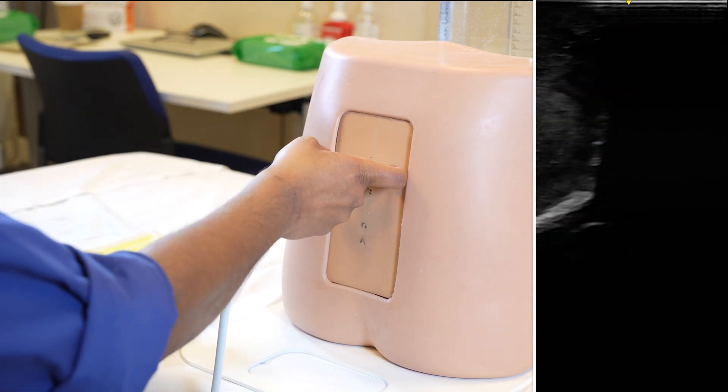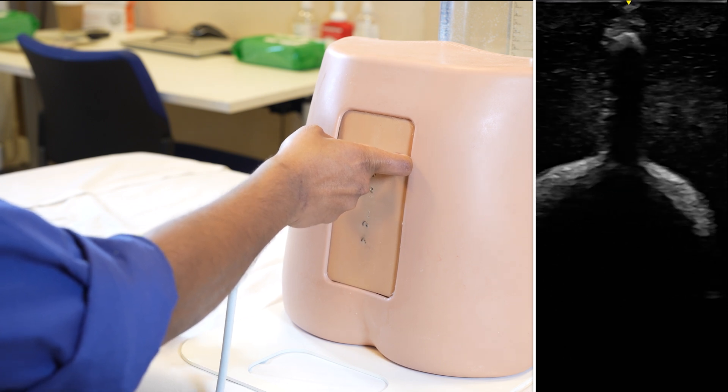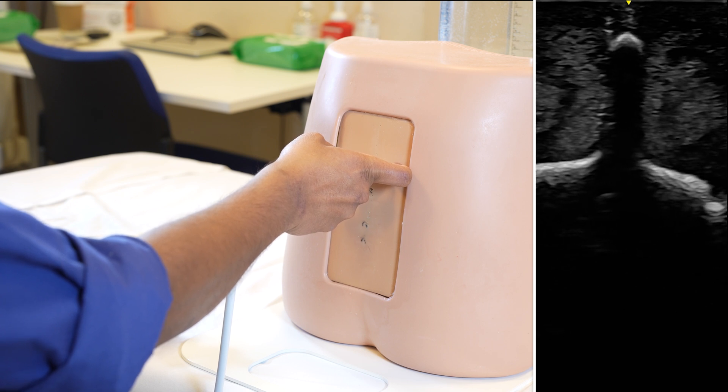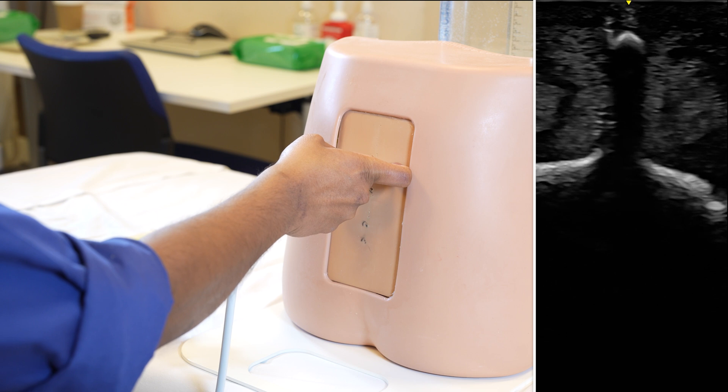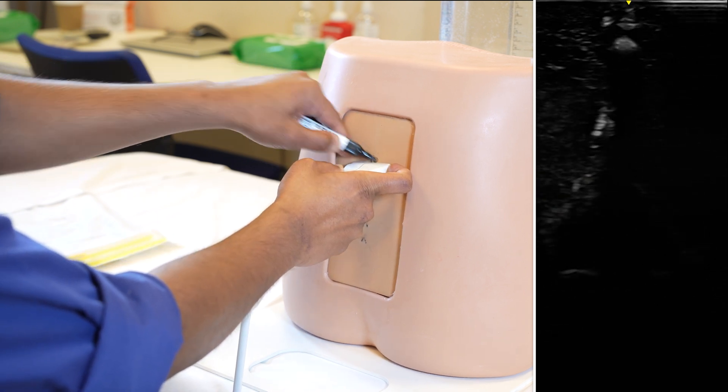Then I gradually go up to get my next crisp hump — the hyperechoic hump with the acoustic shadow behind it. And once I'm happy that it's crisp and it's in the midline, I mark that. And that's my L3.